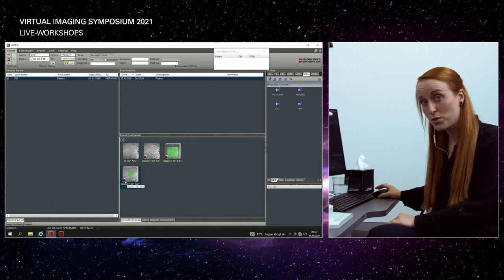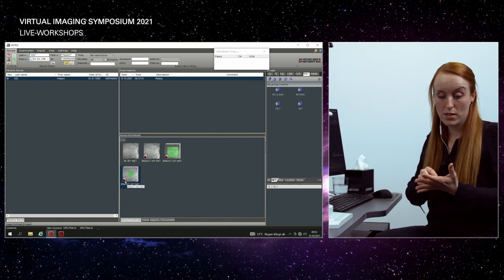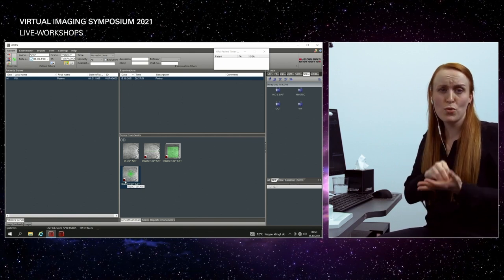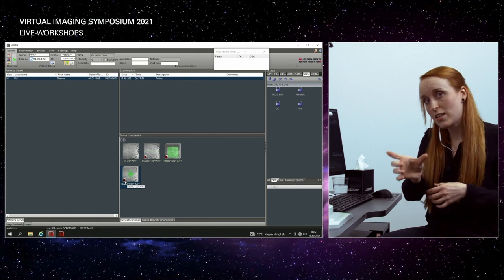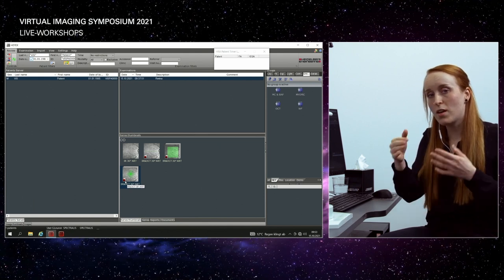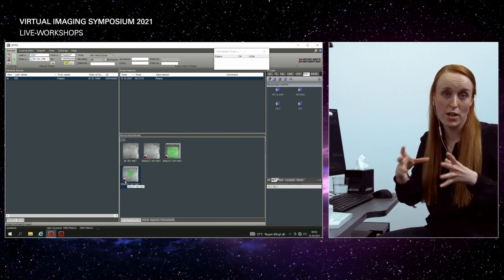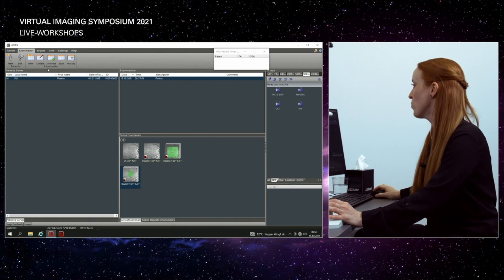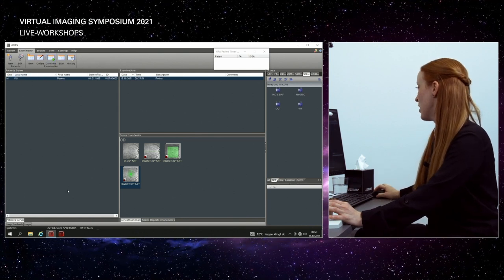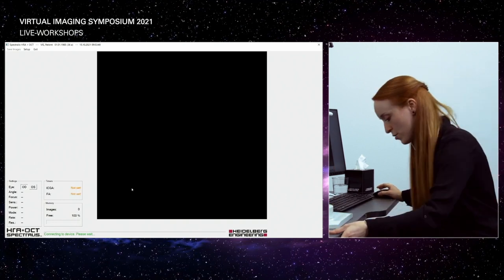And what we are going to do now is a follow-up scan for you, just to remember. A follow-up scan is really important. If we do a follow-up scan, we are able to position the scan exactly in the same position as the last time, and therefore compare really the same structure and can see how it changed. Okay, so let's do this. I'll just go on with this examination and we will see what has changed now.